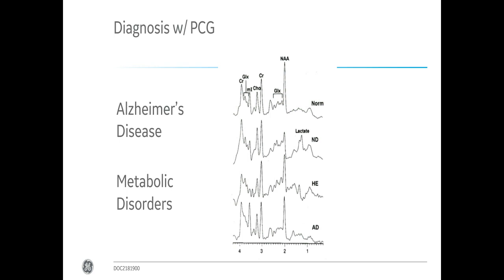with all the other information you have already about your patient, you can give a better diagnosis when you add spectroscopy. So the lack of specificity for some metabolites, again, we know that the metabolites decrease or increase, the different ones in different diseases, but this lack of specificity is not really a problem with all the information you have in addition about your patient.